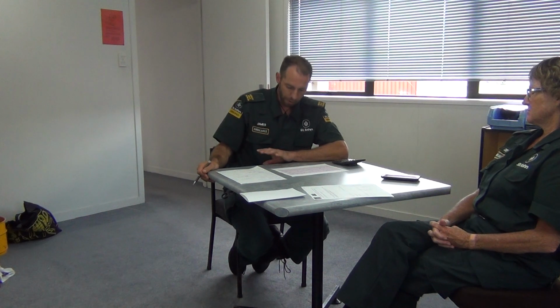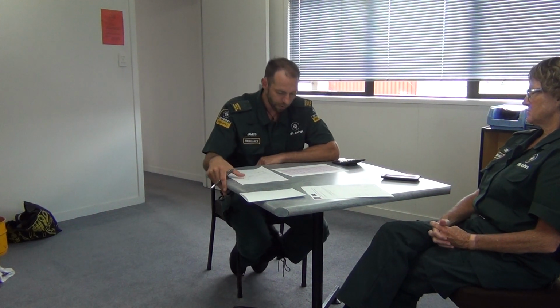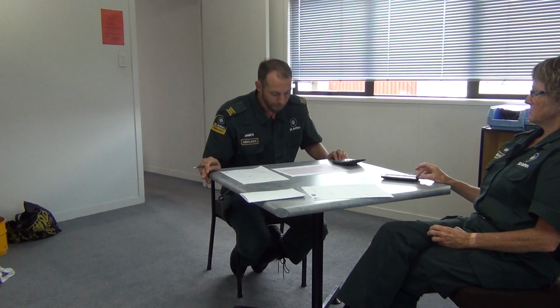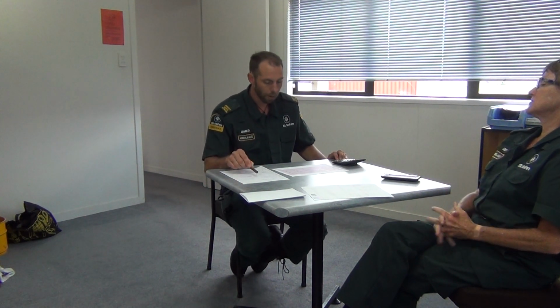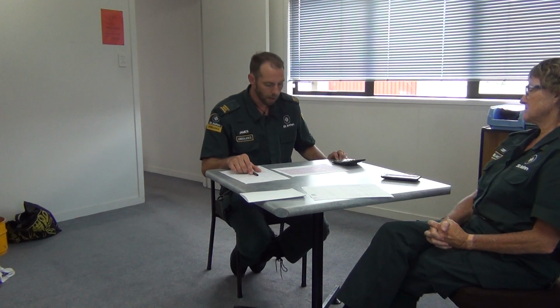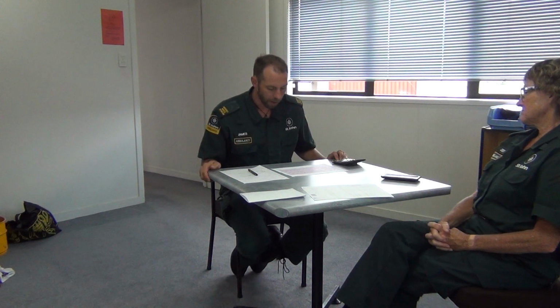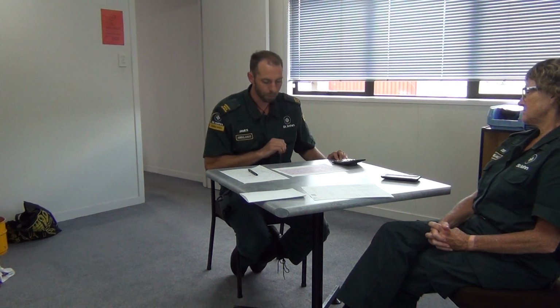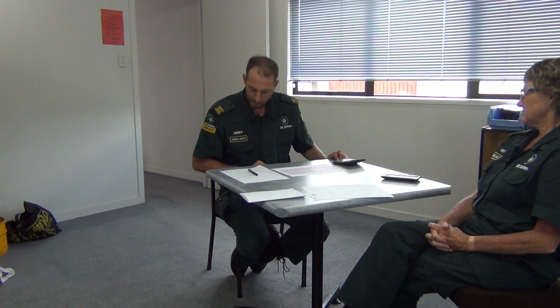So the fact that this ECG has got a wide QRS complex, it's not a bundle branch block, it's not hyperkalemia. I'm going to say that this is Wolff-Parkinson-White because of the delta waves and the shortened PR interval.